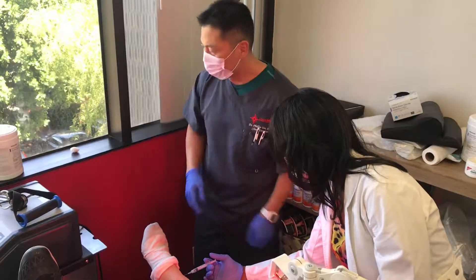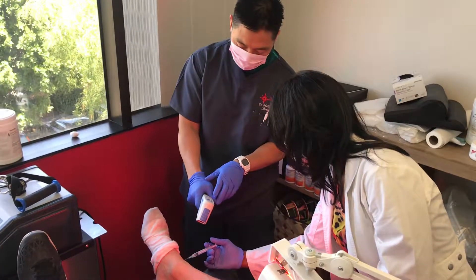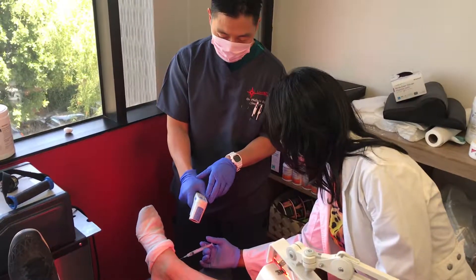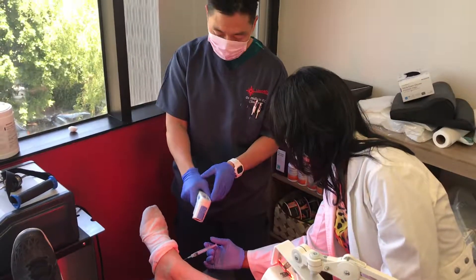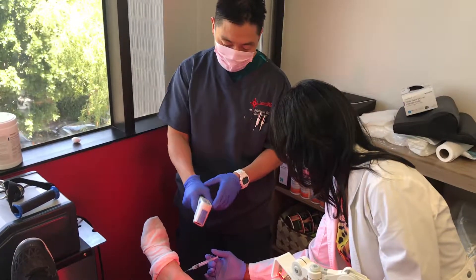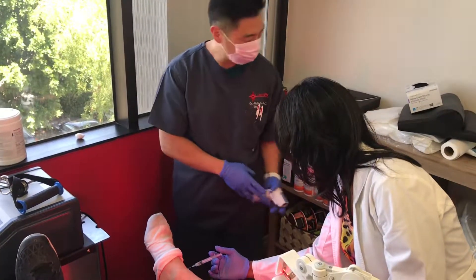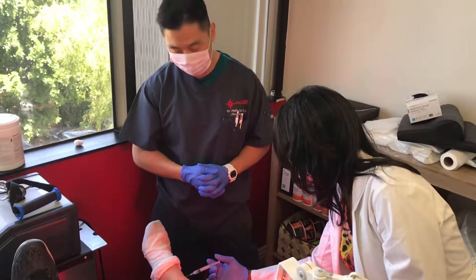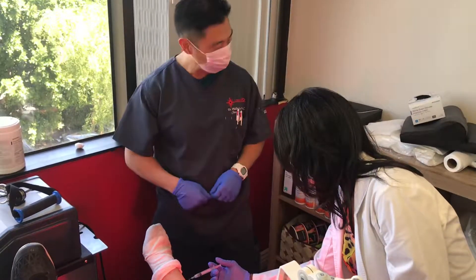I already marked the point of greatest inflammation, which is about the anterior talofibular ligament area. That joint has gone through multiple strains, sprains, and some degenerative arthritis. Now that I've marked the area of greatest inflammation, Michelle is grafting the umbilical cord stem cells in — go ahead and finish that procedure.